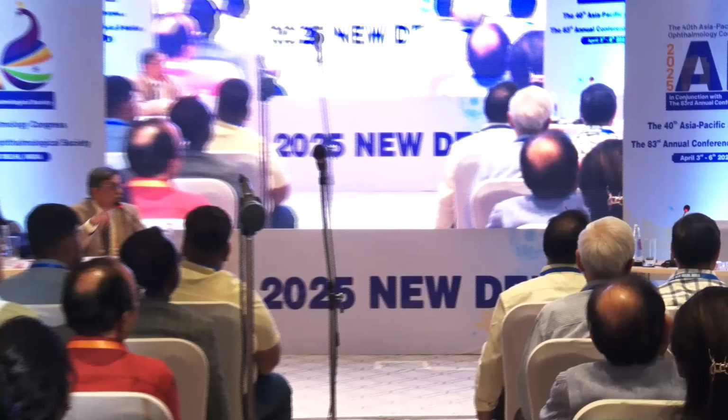That's basic screening. But the unfortunate thing is that too many PIs are done just based on the AS-OCT, which is wrong. Not that you do a PI, but I would not dilate if I have a doubt. Even today, even if I have a clinical doubt, I first get a gonioscopy done. Now, if you're alone in your clinic and you have this, at least you can check out whether you should take a chance or not.